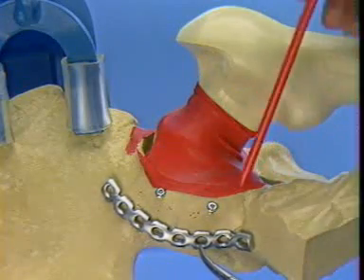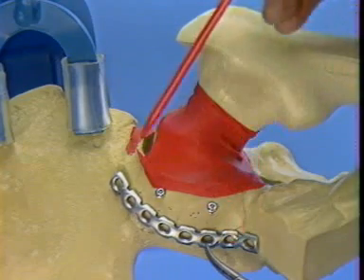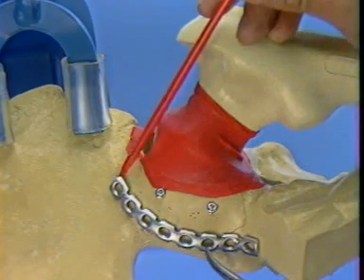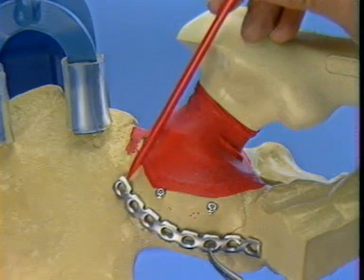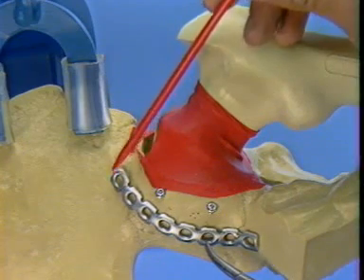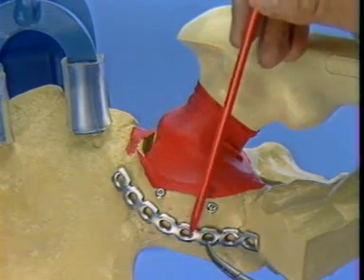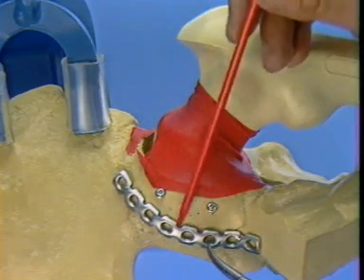At the moment, the plate is slightly under-contoured, so that with the lower end of the plate fixed to the bone, the upper end of the plate is off the bone by 2 or 3 millimeters. The final bending of the plate will actually be done by the screws, which bend the plate across the posterior wall and ensure that the plate places pressure against the posterior wall fragments.